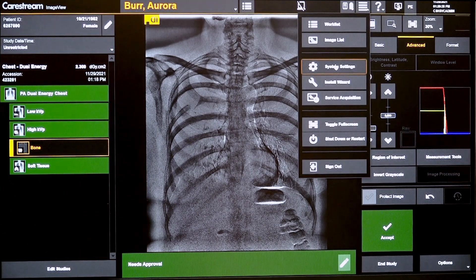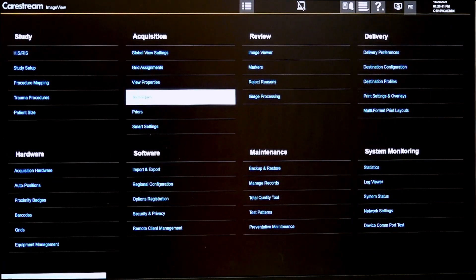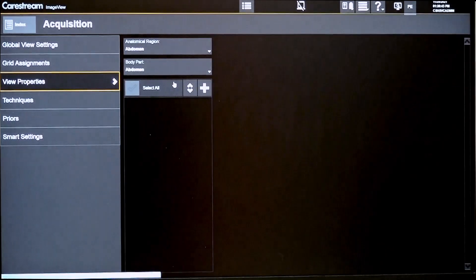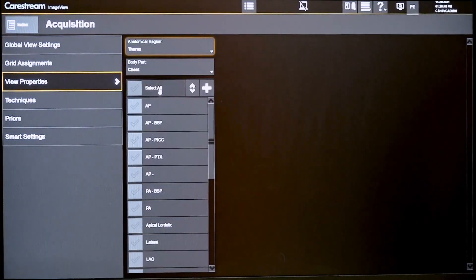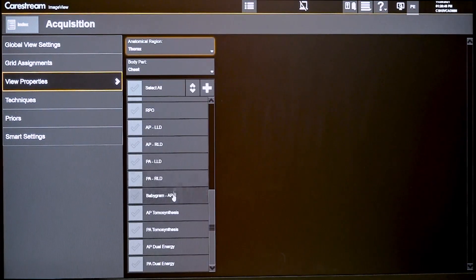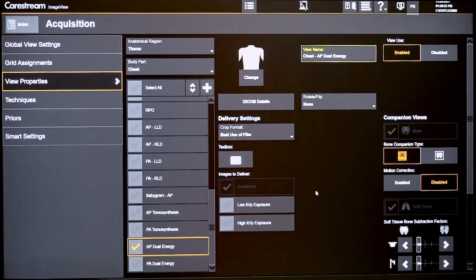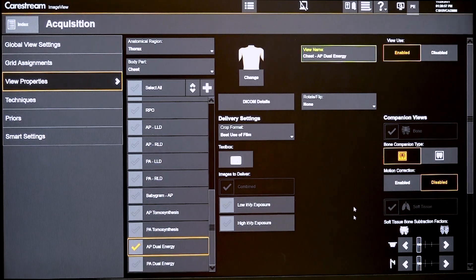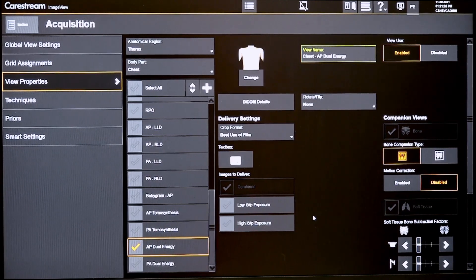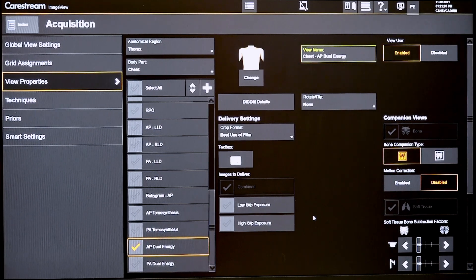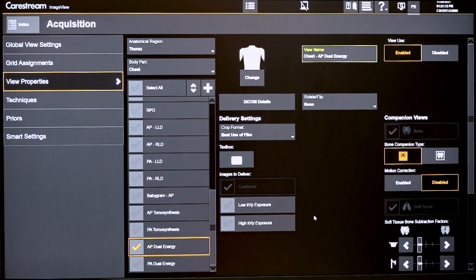If we look at the system settings and go to the view properties, selecting an AP dual energy view shows the configurable settings. The acquisition can be configured to specify what images get delivered — we automatically deliver the soft tissue, the bone, and the composite. The site also has the option through configuration to choose to deliver the low energy and/or the high energy exposures as well.